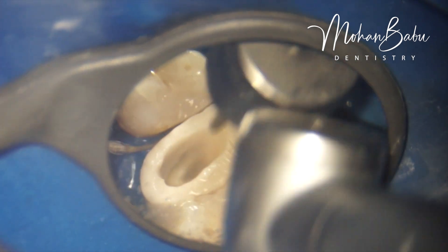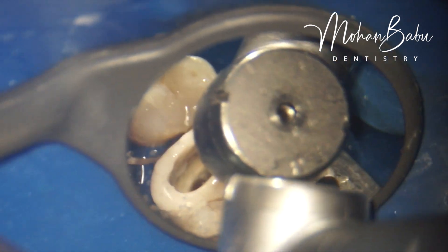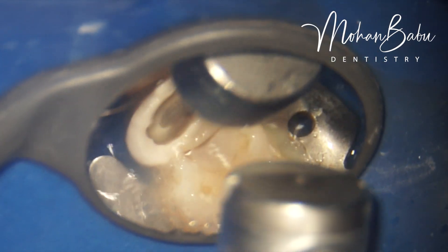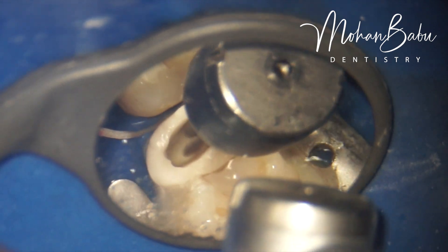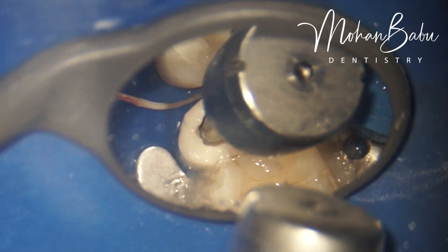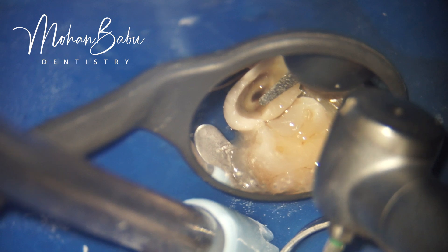Doing an over-contoured pre-endo buildup is very important in this procedure. Only if the pre-endo buildup is over-contoured can we eliminate the GIC in the place of the actual core. If it is not over-contoured, the remaining part of the GIC will be very thin and will break off during the procedure — which we never want to happen. We stress that an over-contoured pre-endo buildup is required so the remaining restoration can withstand stress during post placement and core buildup.